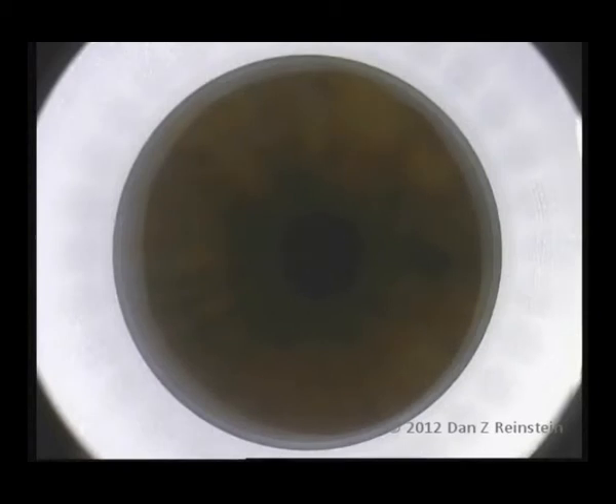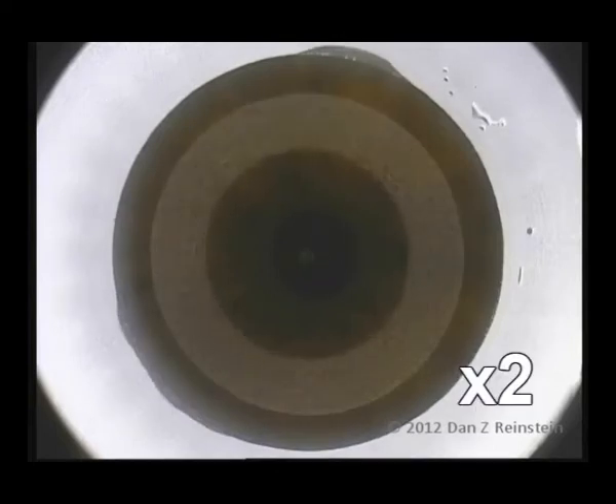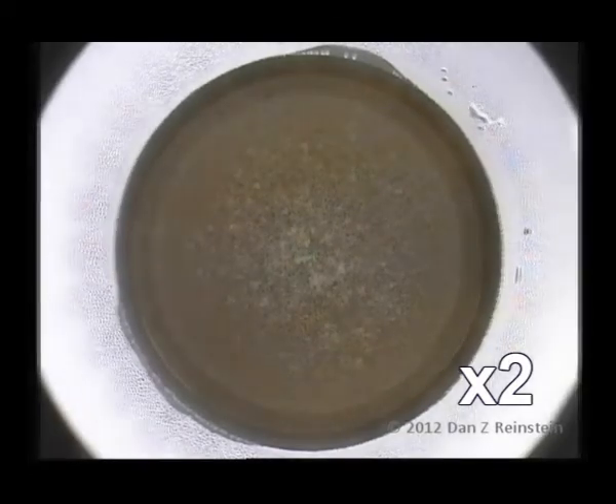ReLEx SMILE is a keyhole form of keratomileusis, essentially a flapless LASIK procedure. A high-precision femtosecond laser is used to cut a three-dimensional refractive lenticule within the body of the stroma, which is then linked to the corneal surface by a 2 mm tunnel incision.